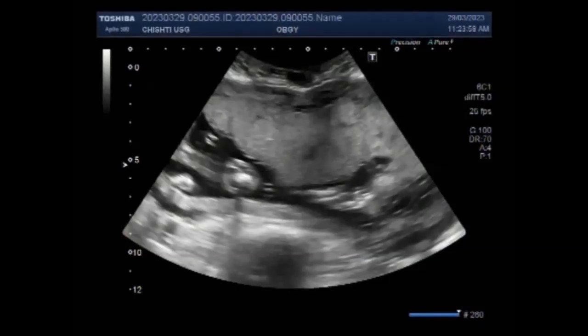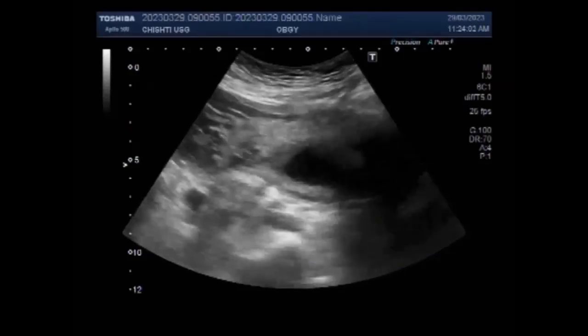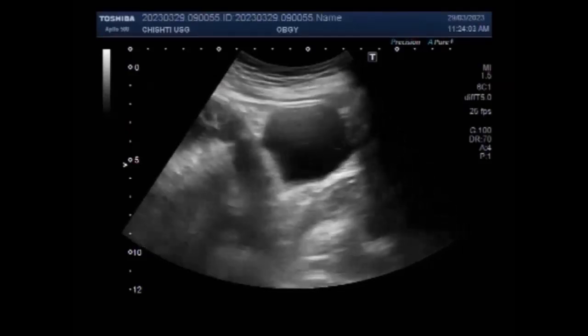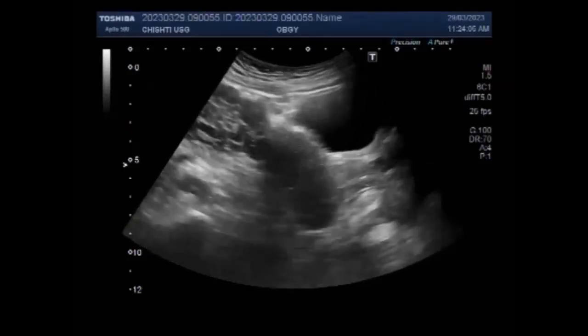Dear viewers, I hope you are all fine. This SuttaSone video shows a pregnancy of about 21 weeks with hydatidiform mole.